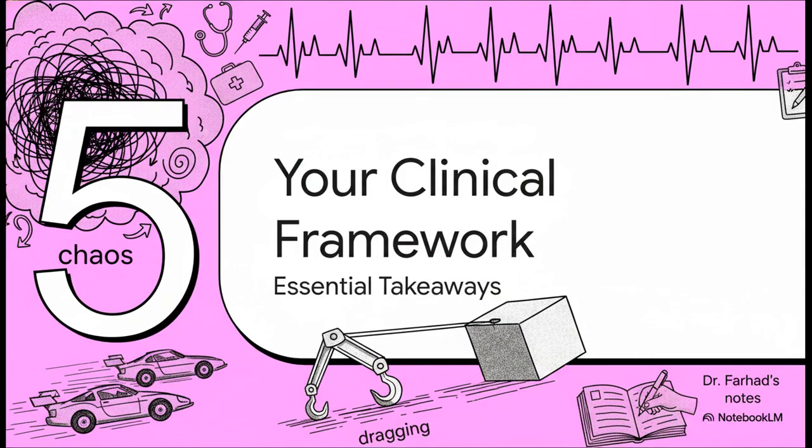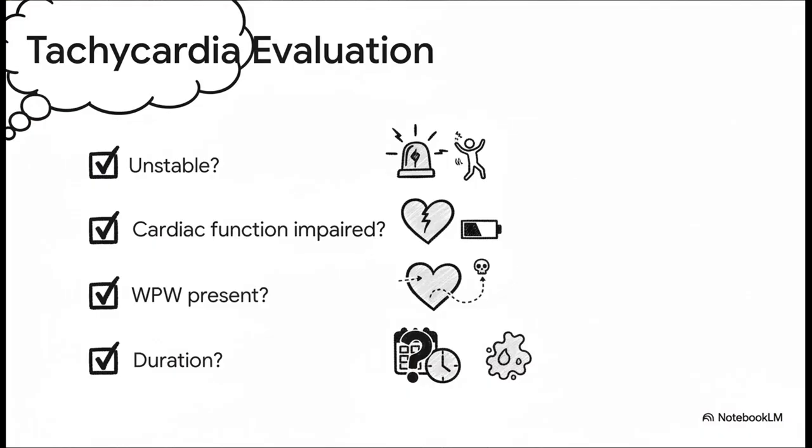Phew. Okay, so we've looked at the chaos, we've looked at the fast, we've looked at the slow. Now let's tie it all together with a simple, practical, clinical framework courtesy of Dr. Farhad that you can pull out in any situation. So here it is. The next time you walk into a room and see a fast heart rate on the monitor, this is your mental checklist.